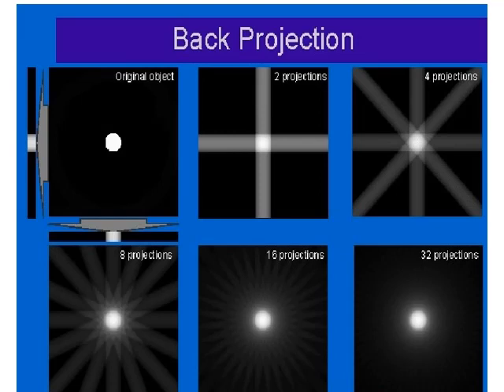And it is reconstructed by the back projection method. In the back projection method, when the rays from two projections are superimposed or back projected, they produce a crude reproduction of the original object. In practice, many projections are added to improve image quality. If we get many projections of the same object, the image quality will be improved and we get a better image of the projected object.